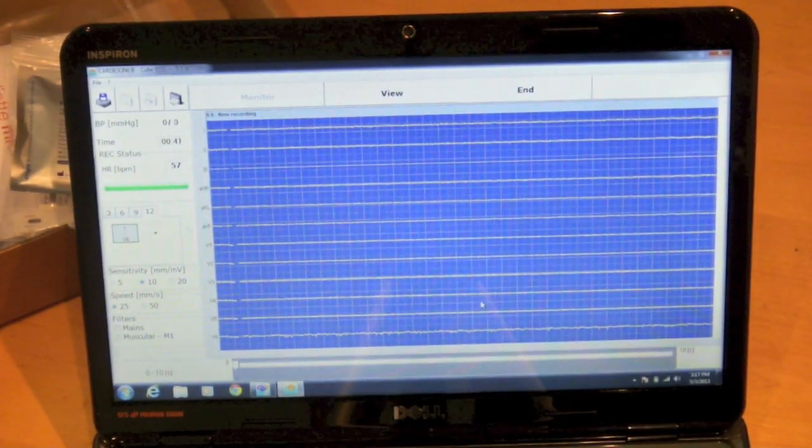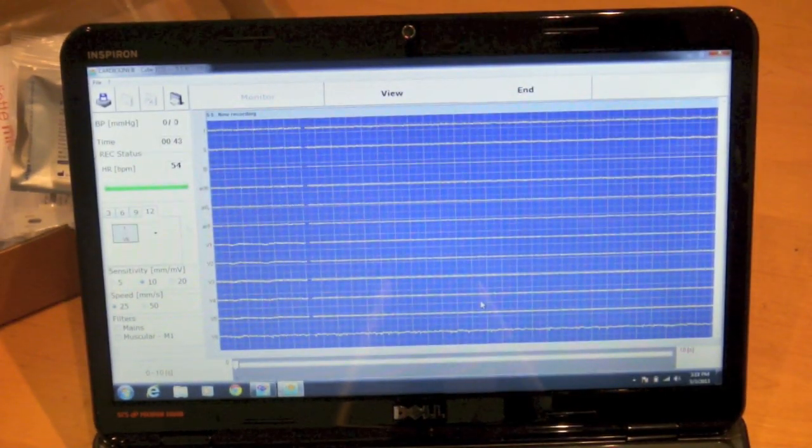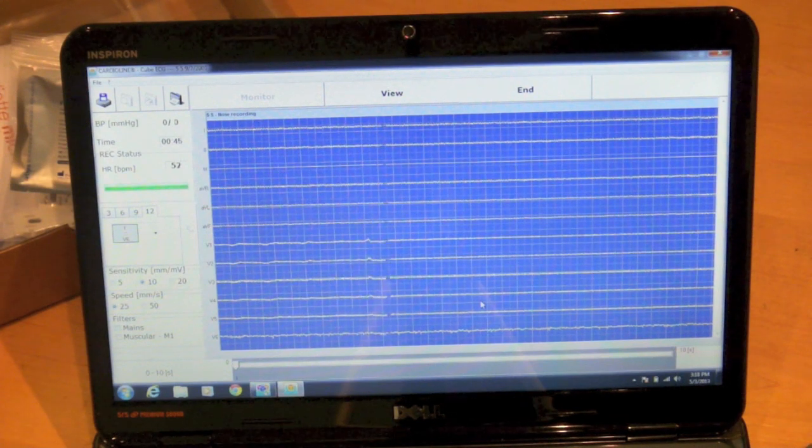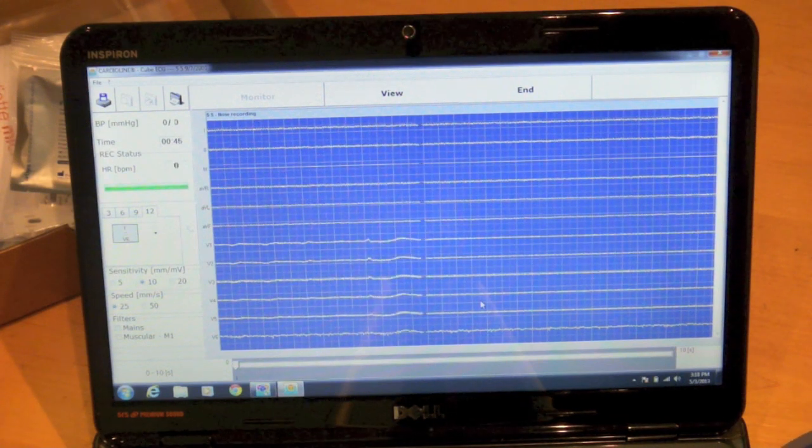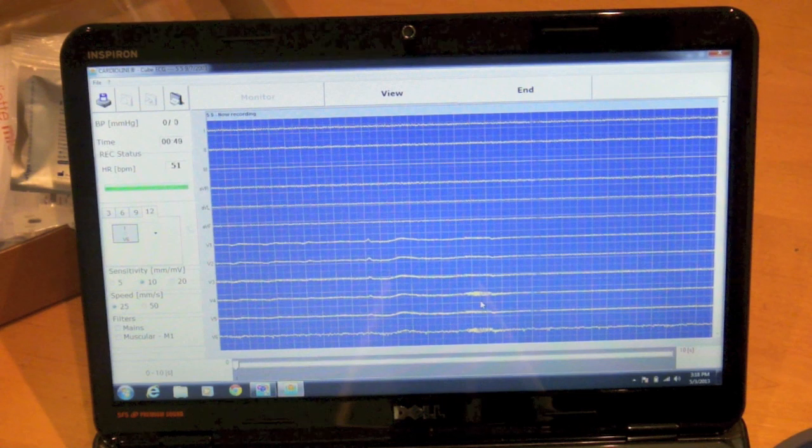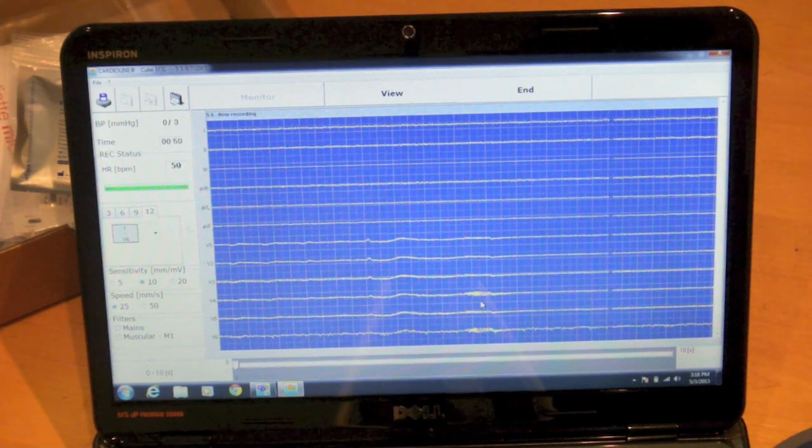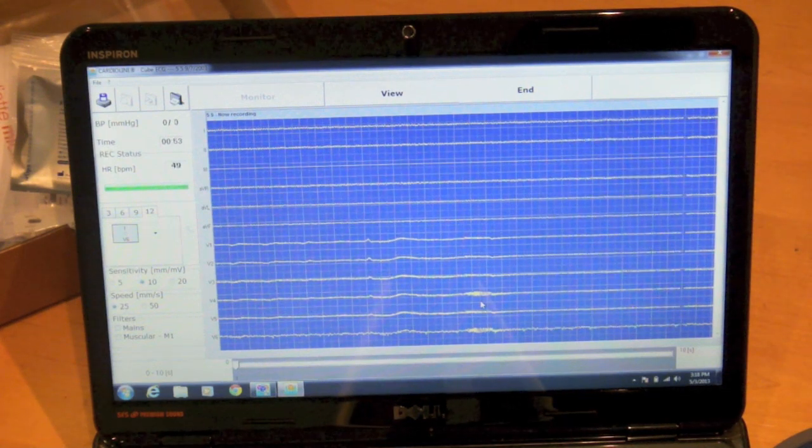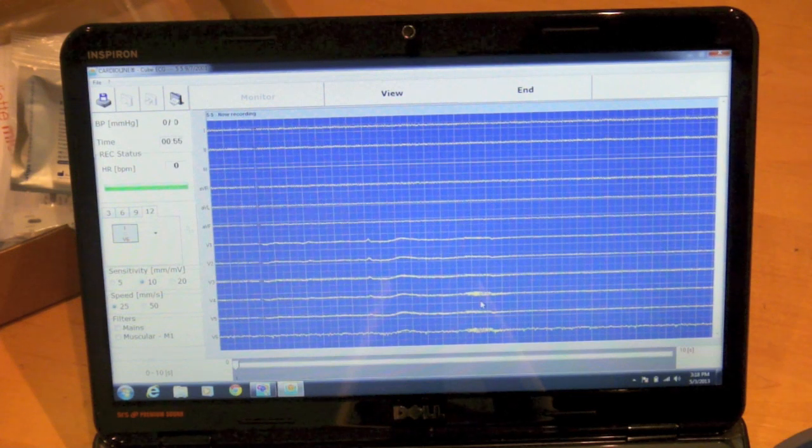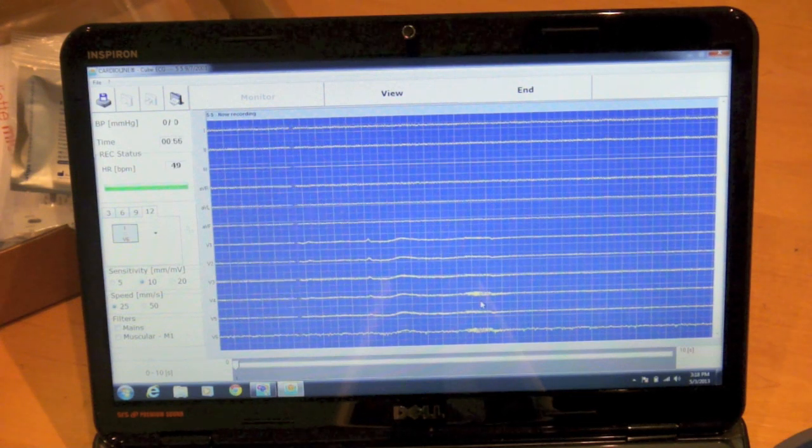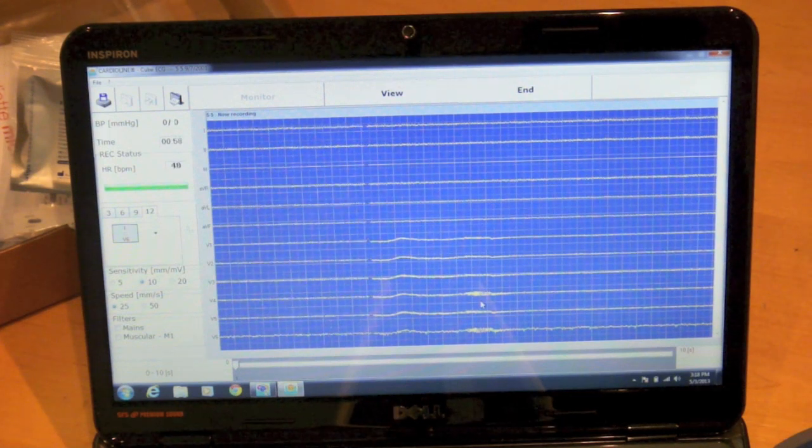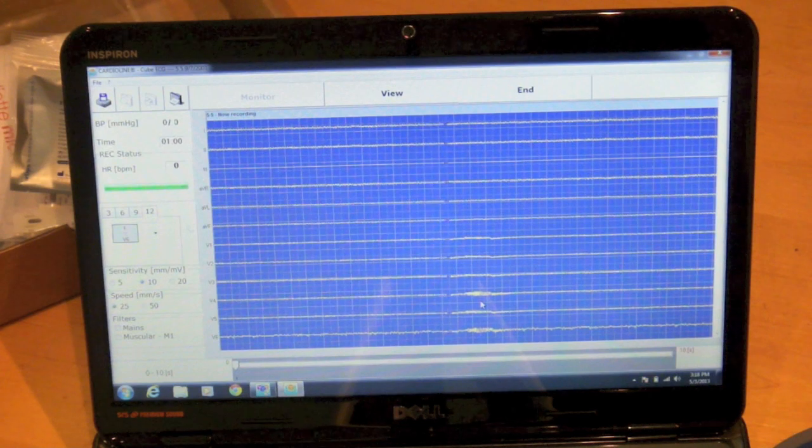So at this point it has begun capturing ECG data. You can see here that all you're getting is some flat lines, a little bit of noise as I move the machine around. I don't have a patient cable plugged in so it is presenting a little bit of noise. But I think you get the idea regarding the real-time data transmission.